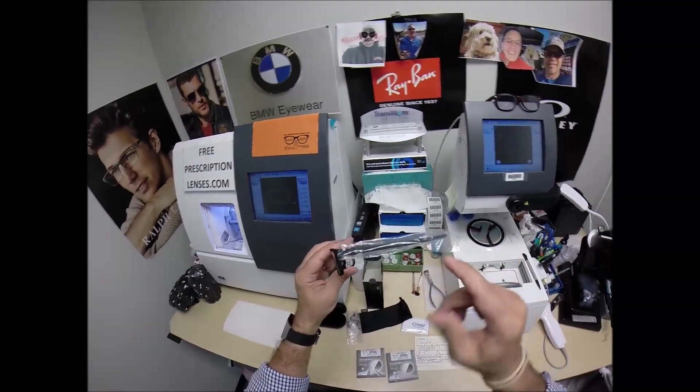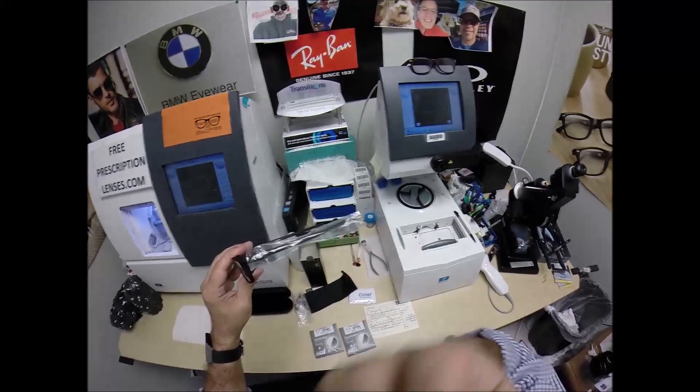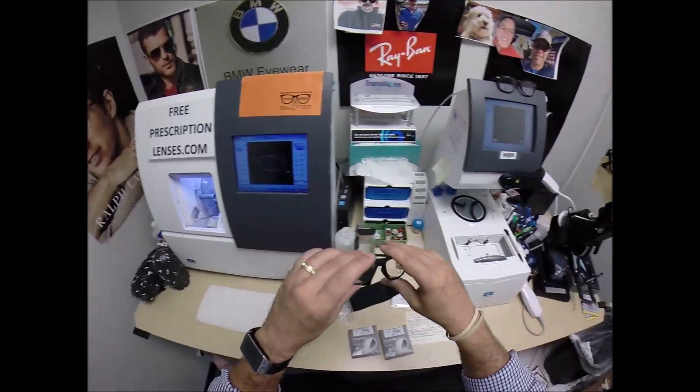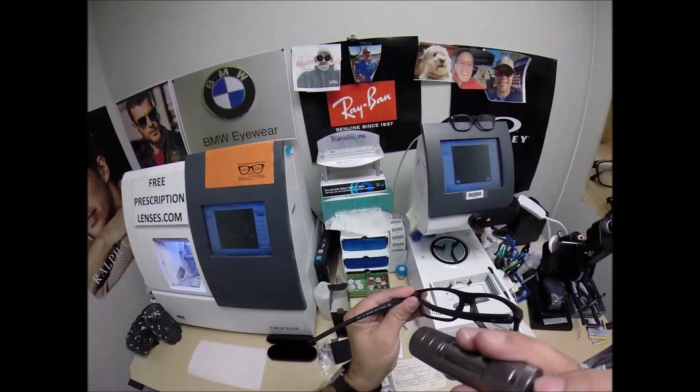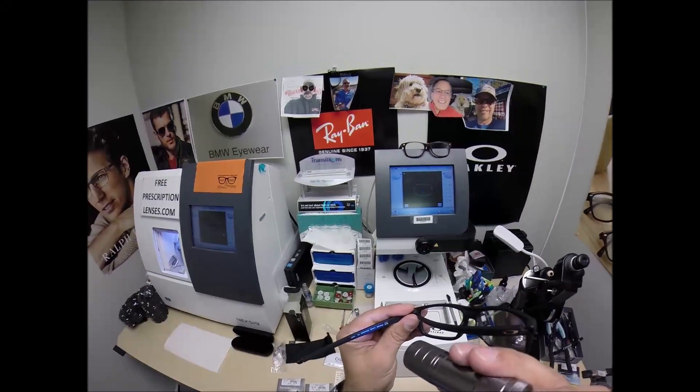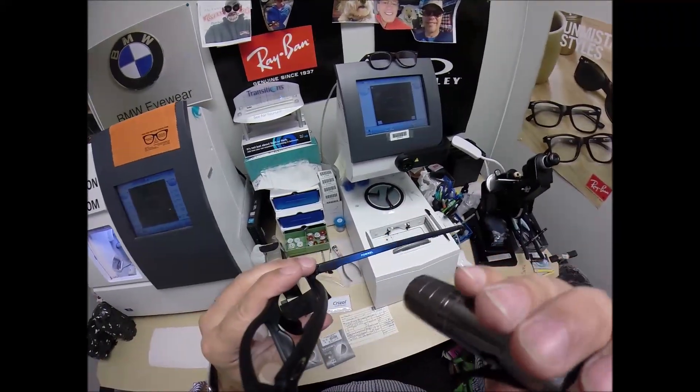This is the frame. It comes with a little plastic sleeve on the left temple to protect the temples from rubbing together during shipping. I'm going to put that on there when I ship to you. This is the Oakley 8127, color 01, the satin black in the 55 eye size. And again, this is the Pommel.